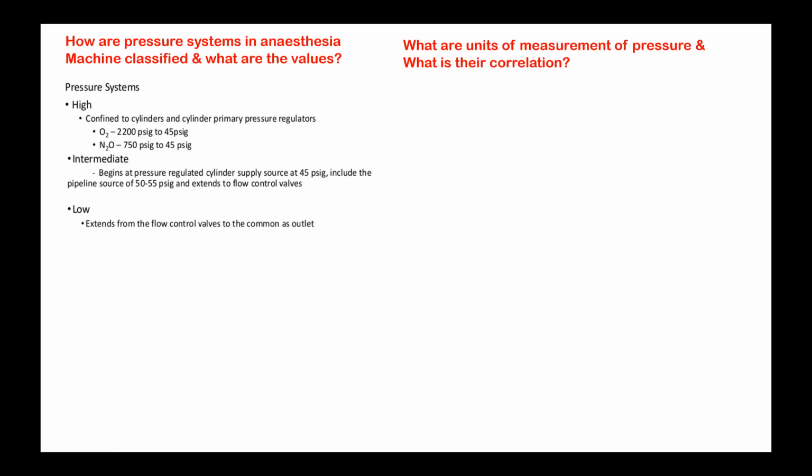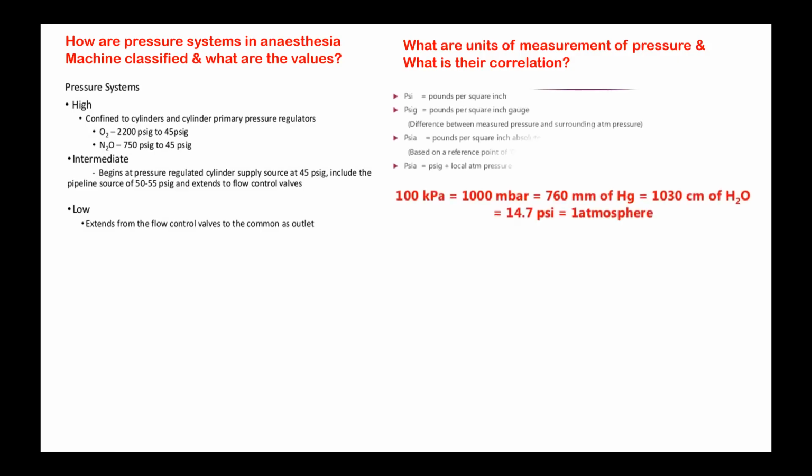That is how the gas is able to come out of the cylinder and out of the machine, because of this difference. You always take the reference point as 0 at the atmosphere, not vacuum. So the gauge pressure is always slightly less than the absolute pressure, and that is the reason the gas is able to come out.